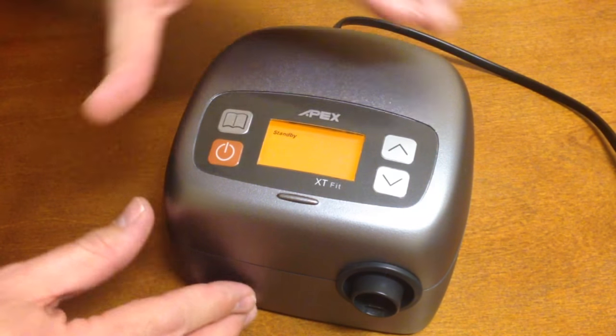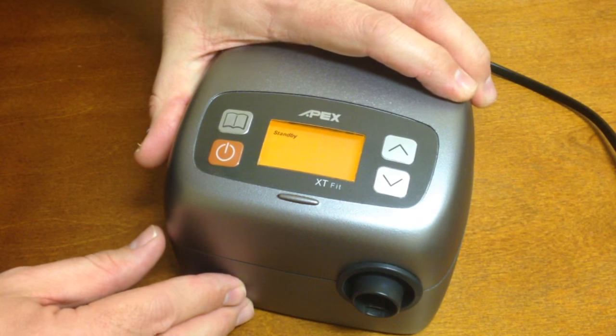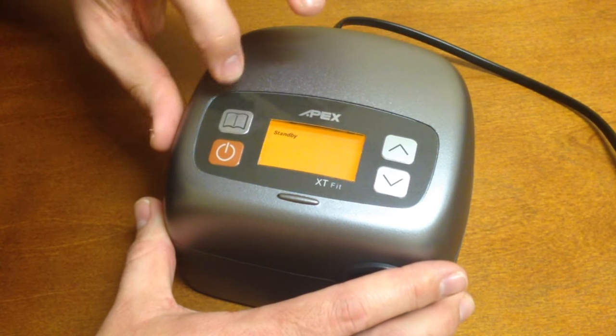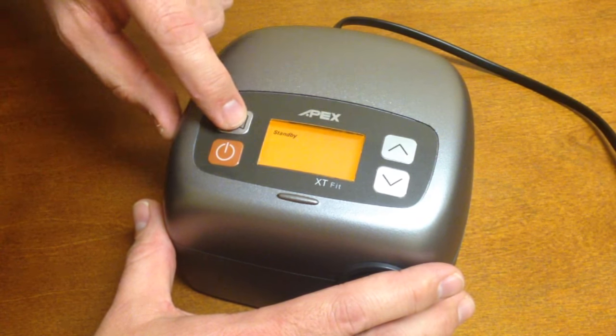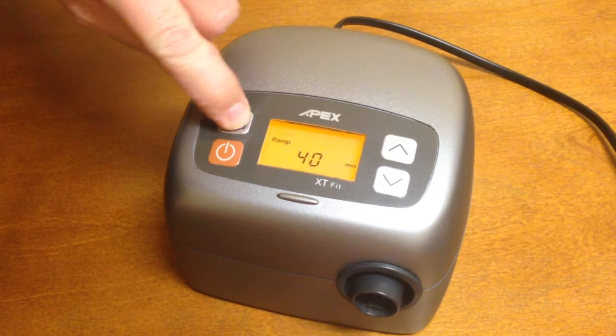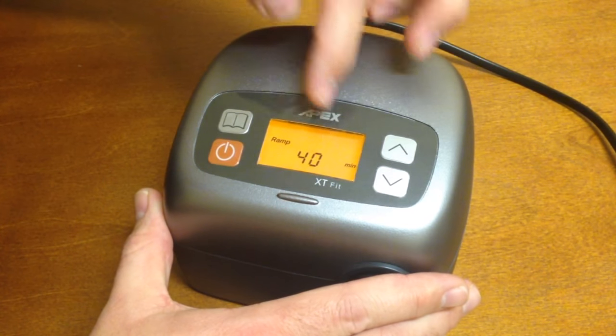To set the pressure on an Apex XT series device, you will first need to go to the setting that you want to change. Using the book button will get you to each option. If I hit the book button once, we have our ramp time.